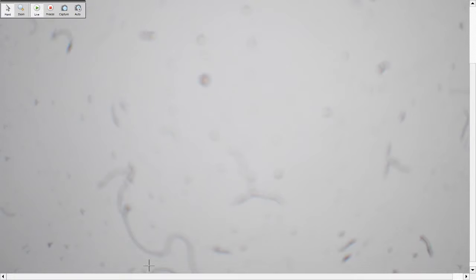CD138 is positive in plasma cells, but also positive in plasmacytoid. So both of them can have CD138 positive, but for plasma cell myeloma or multiple myeloma, EMA is also positive. But these cells here are EMA negative. They are not real plasma cells.